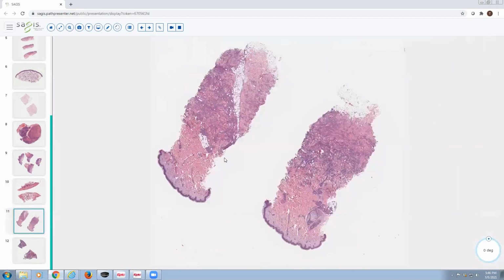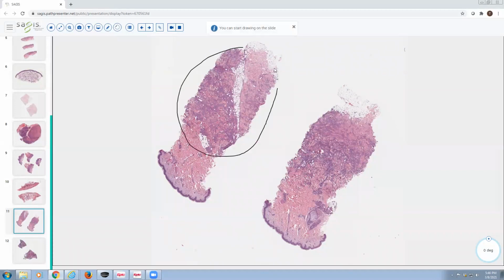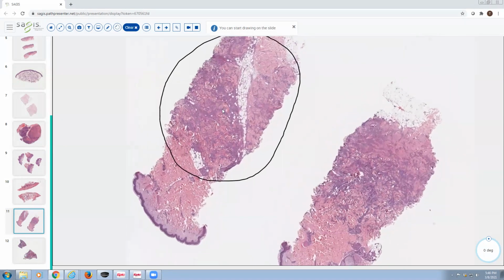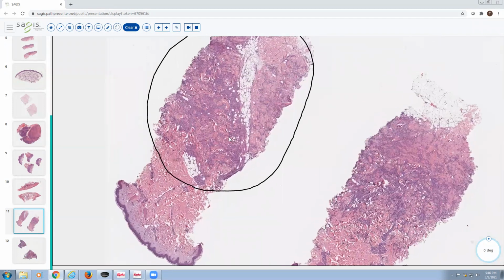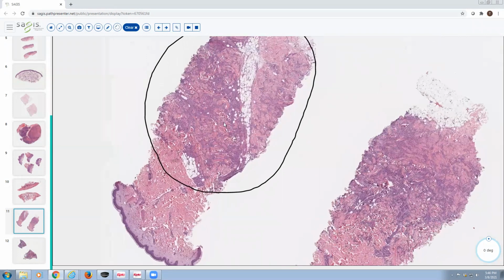Next one is interstitial granulomatous dermatitis. So this is a punch biopsy, and on scanning magnification, you can see that what we're dealing with here is a dermal-based infiltrate. So the pathology is situated in the dermis. Also notice that on scanning, the infiltrate is kind of pale. It's not dark blue like lymphocytes. It's got a little bit more pallor to it, which suggests histiocytes.